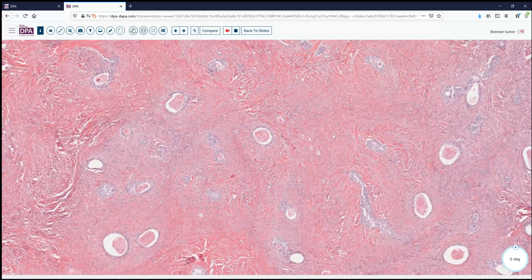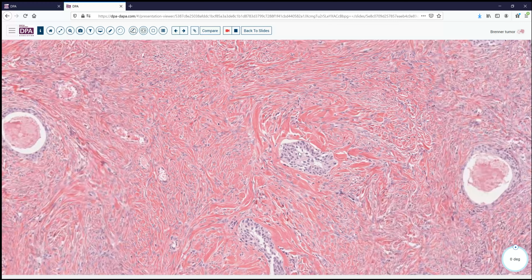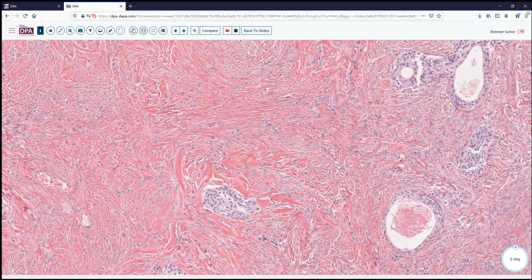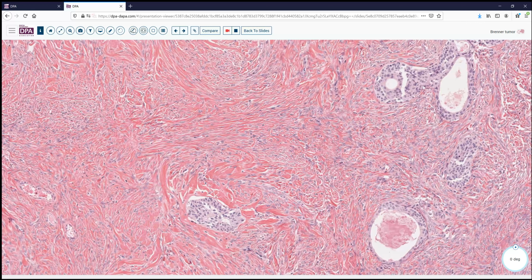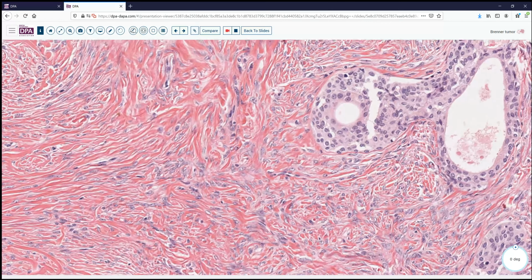We have more cystic formation here, but as we look, we also see many of them are not particularly dilated, and it's not a mucinous type of epithelium or a serous epithelium. This is our friend, the transitional type of epithelium with just more prominent cystic spaces. Again, we can see a few nuclear grooves, very bland, low-grade nuclei that make this a benign entity.